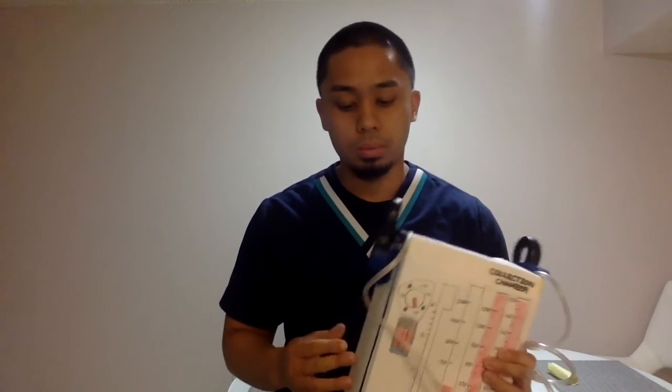First things first, just to go over what this is used for. It's used for patients who have air trapped in the pleural space, which is common in patients that have undergone chest trauma, and ultimately it can lead to complications such as tension pneumothorax. So, that said, I'm going to get started with the procedure.